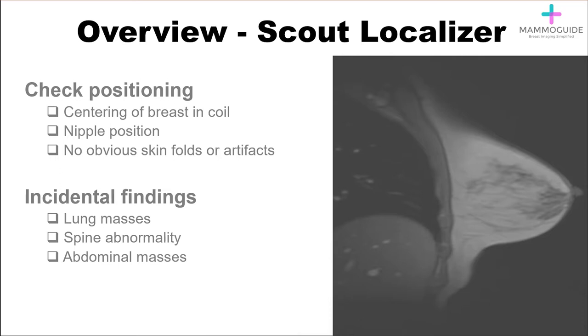Occasionally, you'll come across a large lung mass, a spine abnormality, or an abdominal mass that only shows up on the localizer images. They're rare, but certainly important.